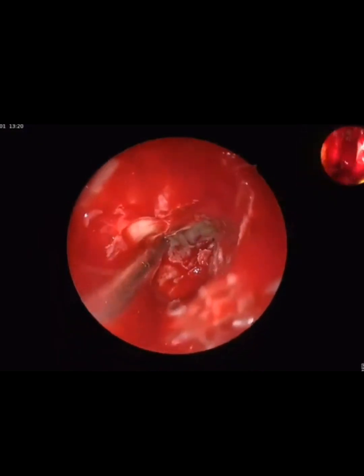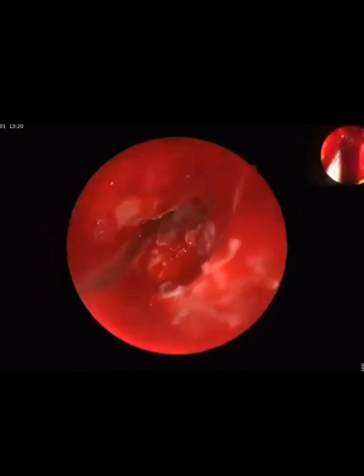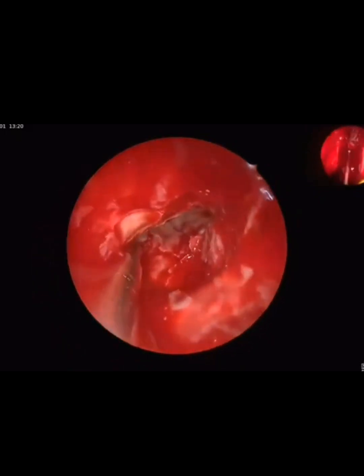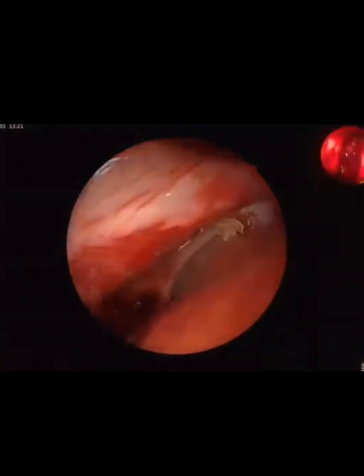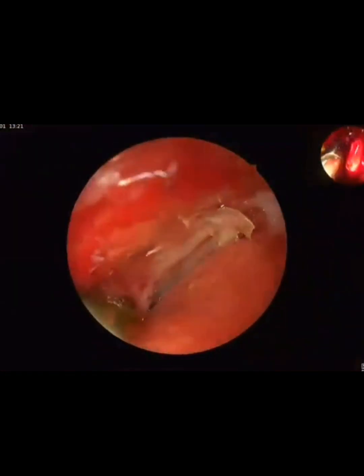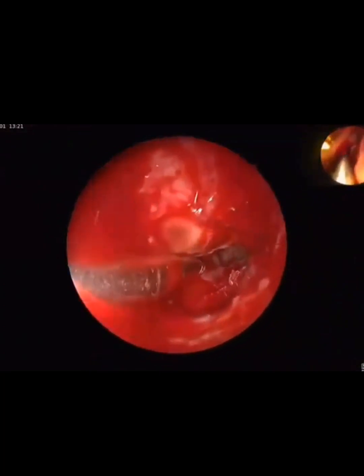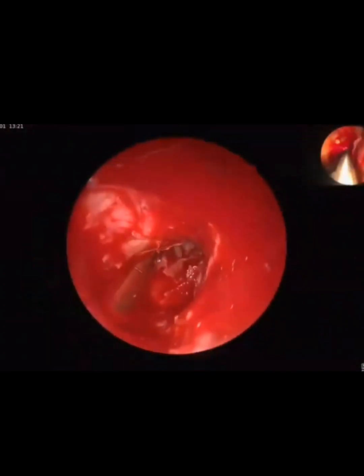Wait, don't talk, don't irrigate. I think the suction is blocked. Open the suction. Don't irrigate, wait, it comes in the way of the endoscope. Don't irrigate for a few seconds. See my 120-degree blade: I open the blade, reaching the target area.